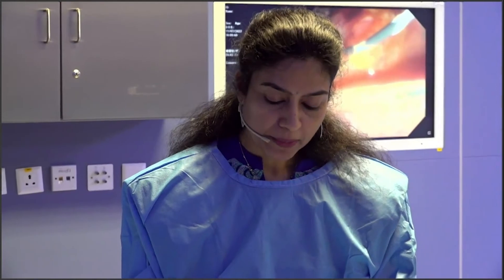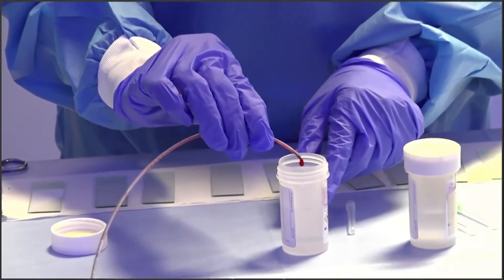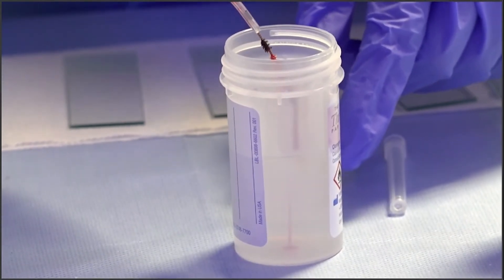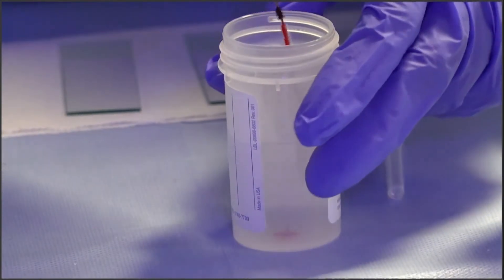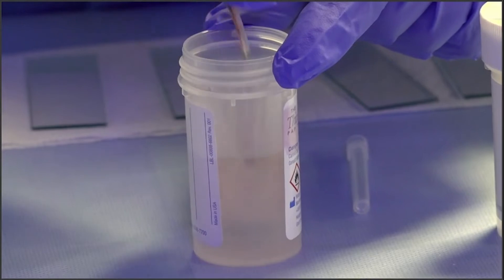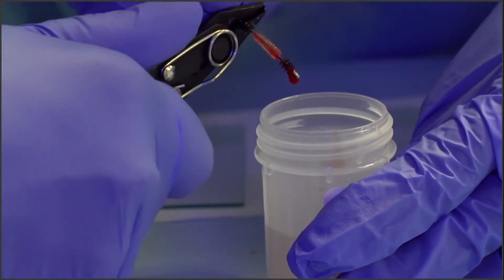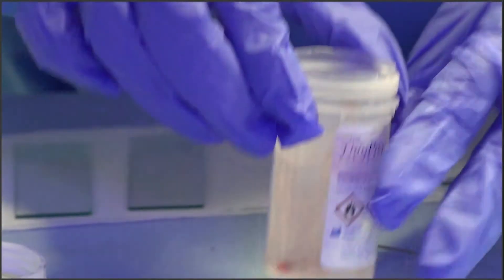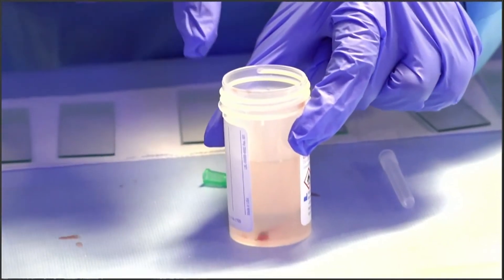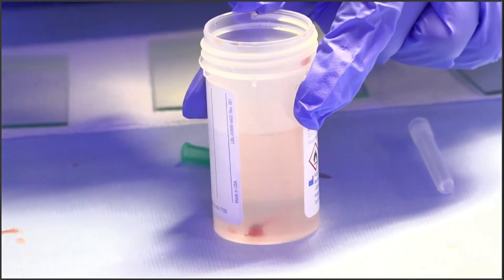For optimal retrieval of cytology material in the second pass, we directly drop all material into the Cytolyte fixative. We then rinse the brush into the fixative so that any particles stuck to the brush are collected. A blade cutter is used to detach the blade and brush, and the cut end of the brush is dropped into the fixative. This allows particles trapped between the white and black bristles to be fixed in Cytolyte, which can be processed as a cell block for ancillary tests.